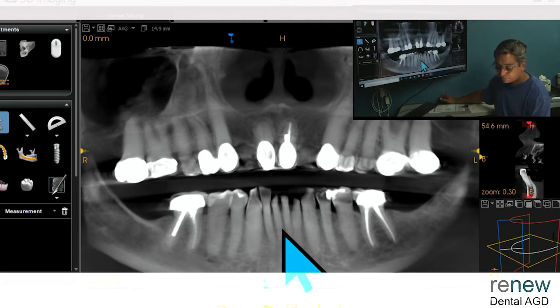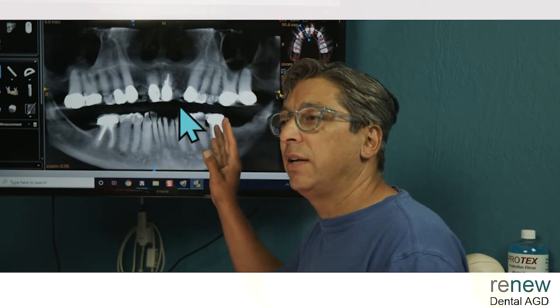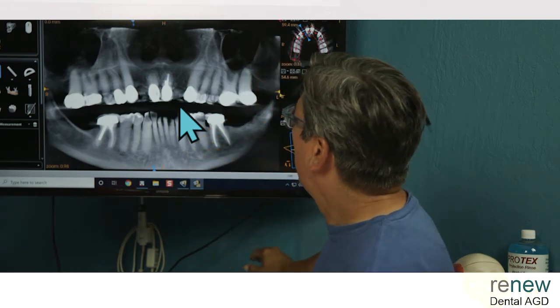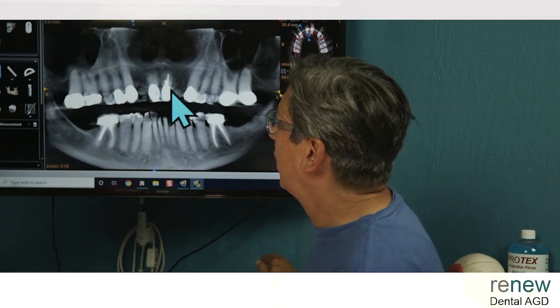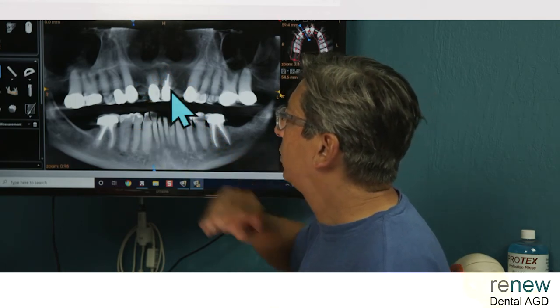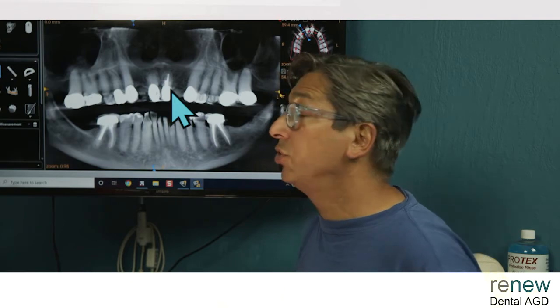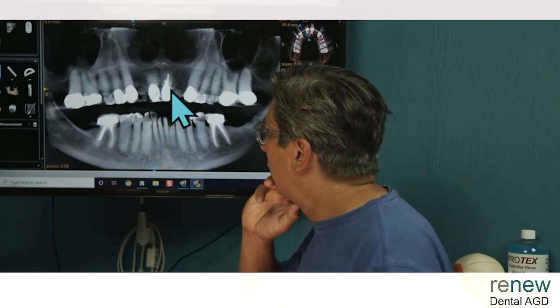So this one, unfortunately, we have not seen this patient back. We did take a pass on it, meaning that I don't think there was really much we could do to help him, especially if he's only looking for implants. Even if you graft this site, it's not going to be good enough. You're really stuck here. From a panoramic point of view, it looks pretty good, but there isn't really much you can opt in with.